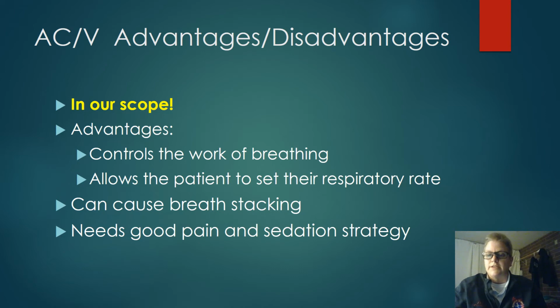It's just going to assist them with that entire tidal volume, and that can cause that breath stacking. So we always need to remember that good pain control and sedation strategy. Please, please, please keep that pain control and that sedation down, okay?